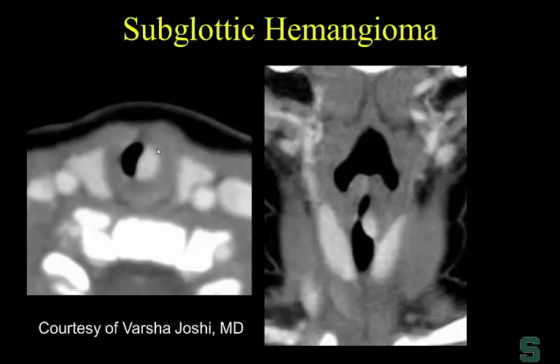This is a classic example of a subglottic hemangioma. We tend not to image these very frequently — pediatric otolaryngologists will see them, and if they're not obstructing the airway, sometimes they resolve. But if we do see them on imaging, they're typically located in the subglottis with some compression of the airway on axial and sagittal images. The characteristic finding is dense enhancement within the subglottic hemangioma, typically in a child — often a newborn with stridor.